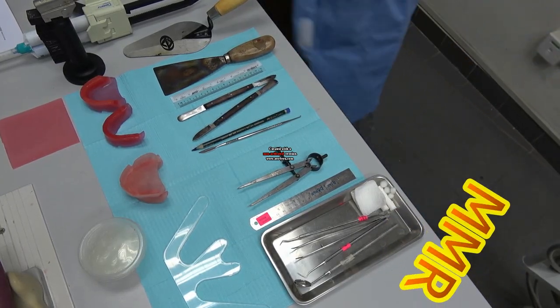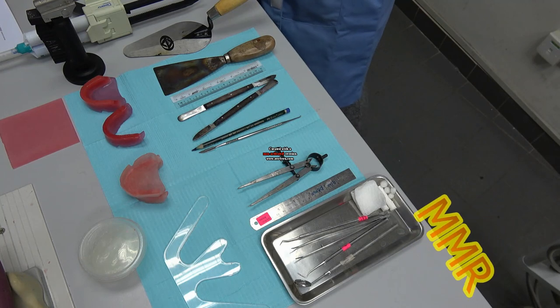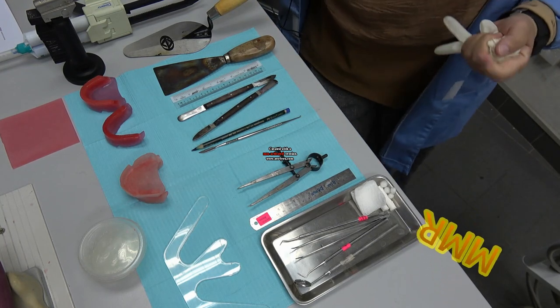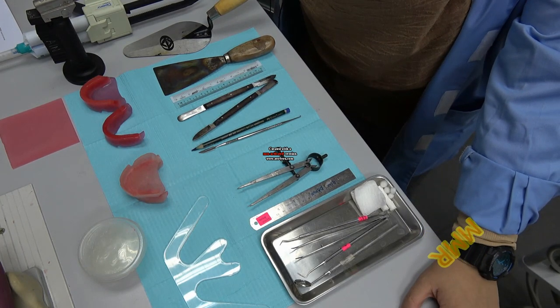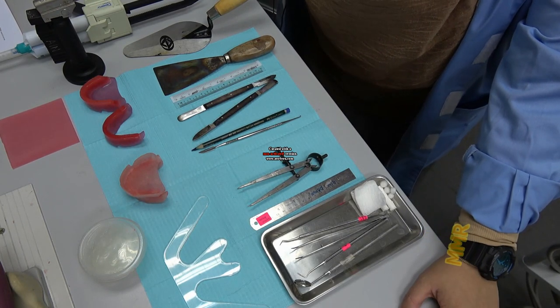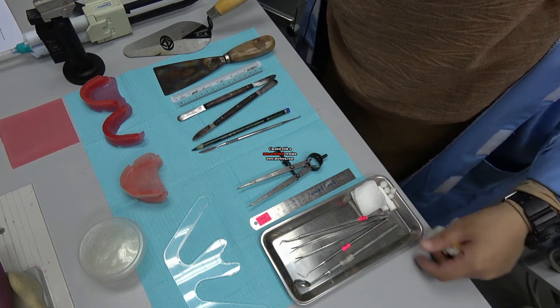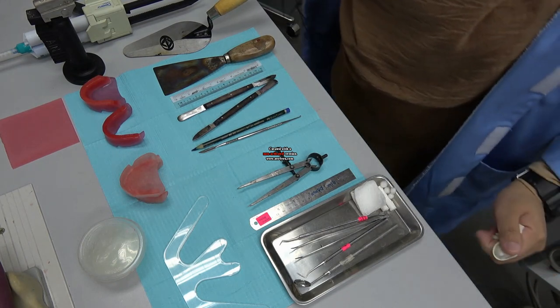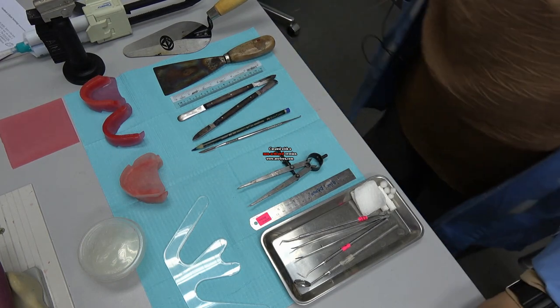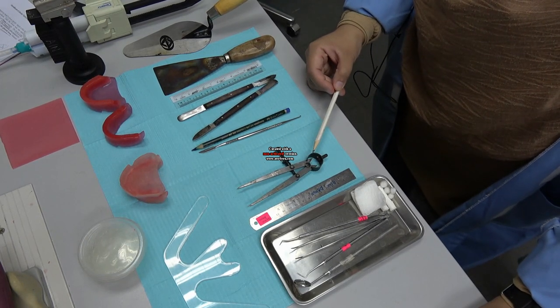Okay, our demo today is on maxillomandibular registration, or we call it MMR. This is the armamentarium that we need for this exercise. First of all is your E-set, and then a ruler. And this is the caliper.